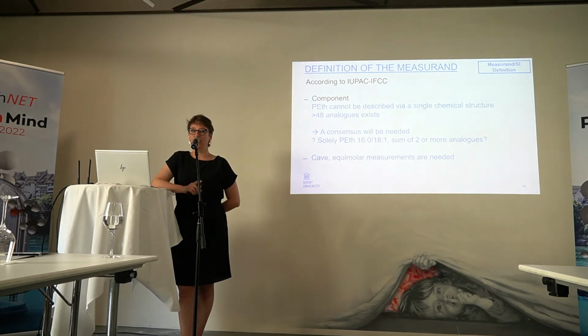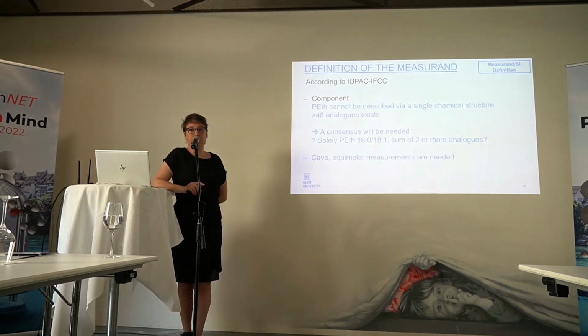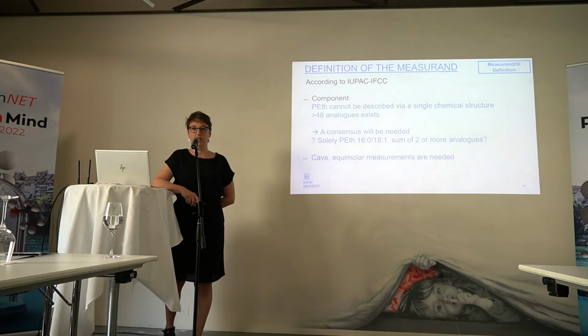And also, we need to make sure that we have equimolar measurements, that we can measure all the analogues with exactly the same specifications in terms of CV and accuracy, which is very important, especially if you would like to quantify low abundant analogues.